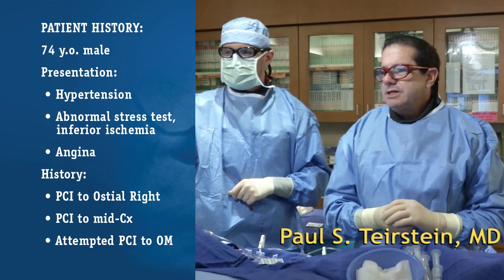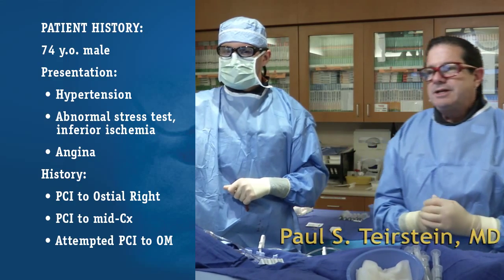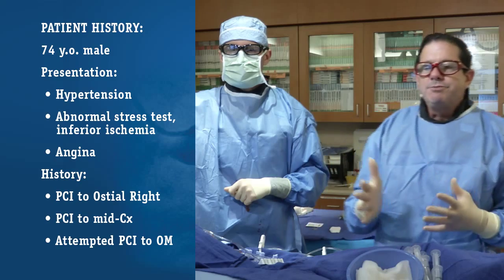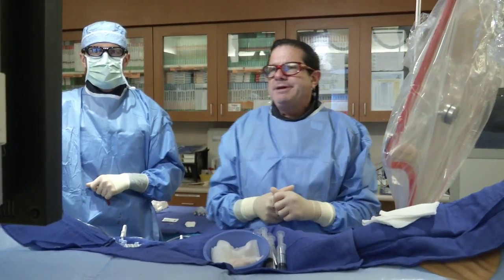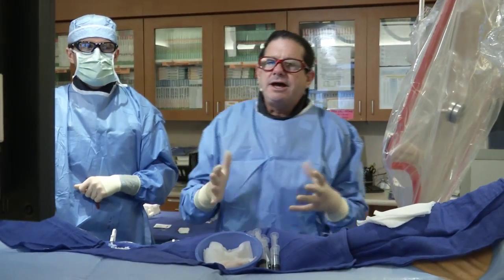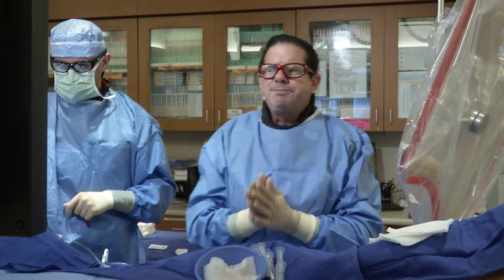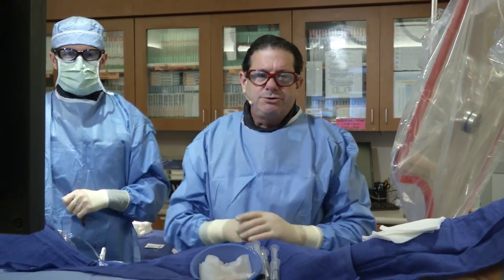His physician tried to treat him and could not get the obtuse marginal open. He was sent here — the prior physician could not get full dilatation of the balloon, tried to put a stent in, the stent unfortunately wouldn't go, so he gave up on the circ, which was the right move, I think.